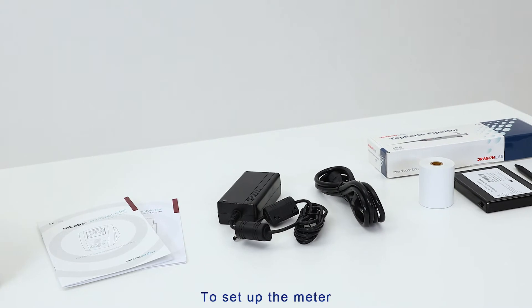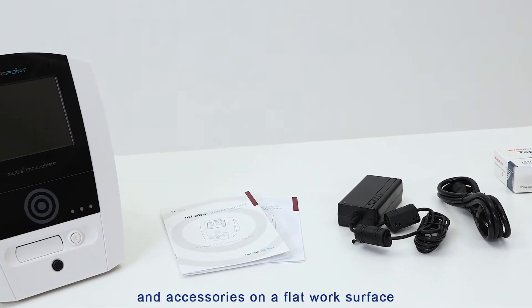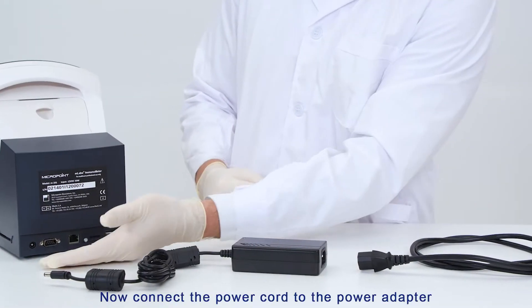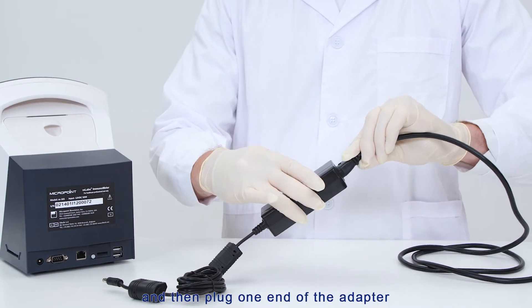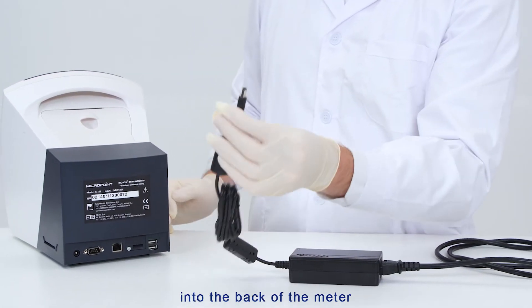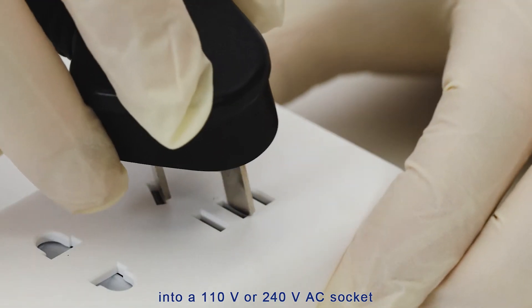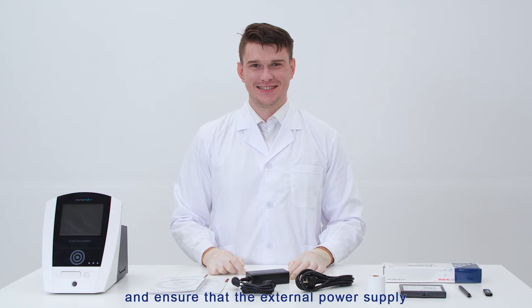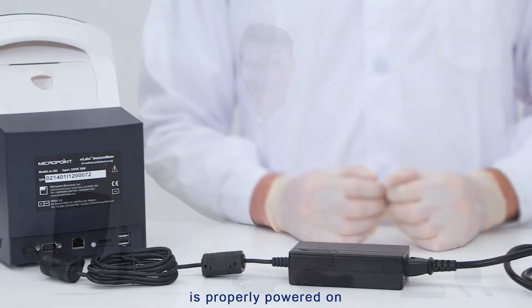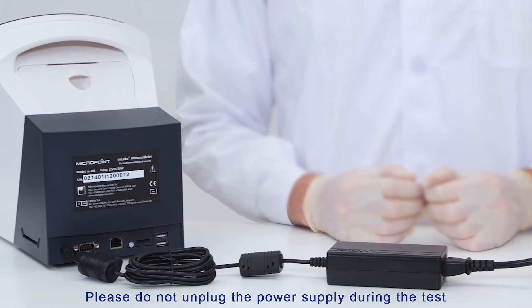To set up the meter, place the M-Labs Immunometer and accessories on a flat work surface. Connect the power cord to the power adapter, then plug one end of the adapter into the back of the meter. Plug the other end into a 110 volts or 240 volts AC socket with grounding protection, and ensure the external power supply is properly powered on. Please do not unplug the power supply during the test.